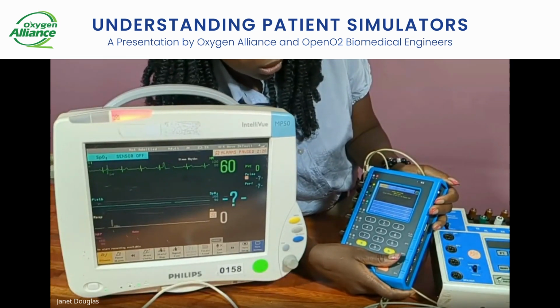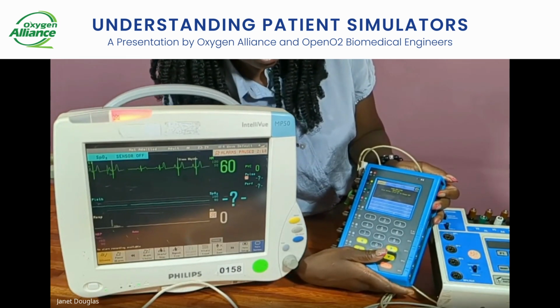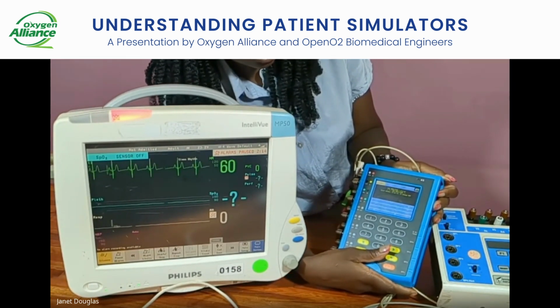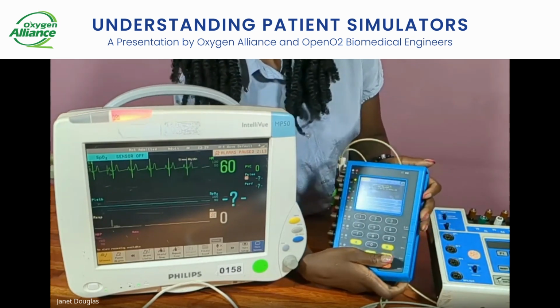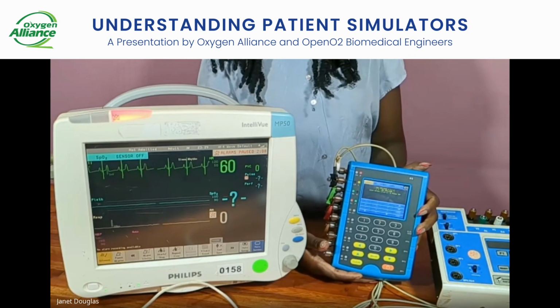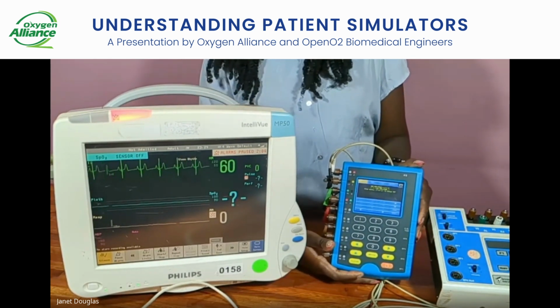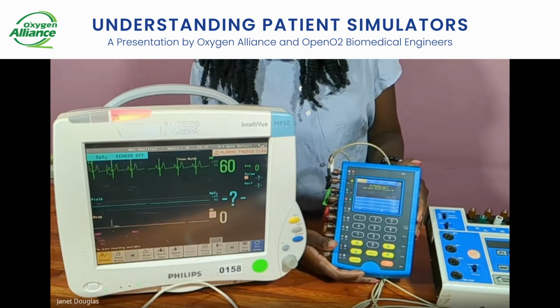All right, so I've set the amplitude at 2 millivolts, and then I have now placed enter, which is okay. It doesn't matter whether I change the amplitude, in as much as at first it was at 1 millivolts and now it's at 2 millivolts, I'm still getting the same results.